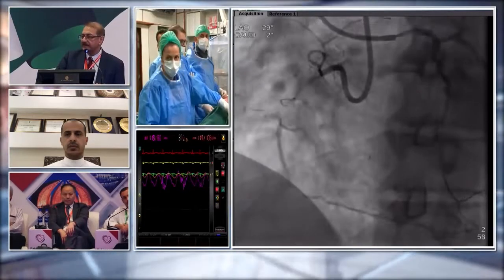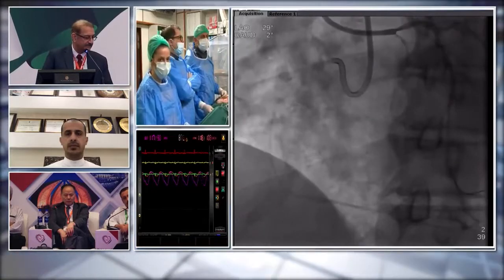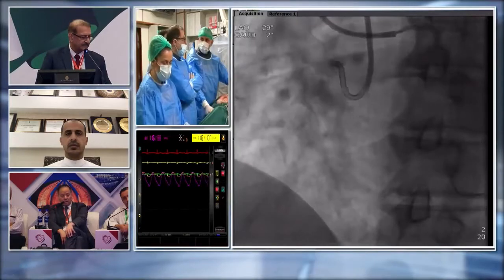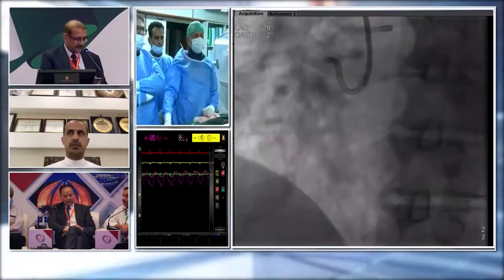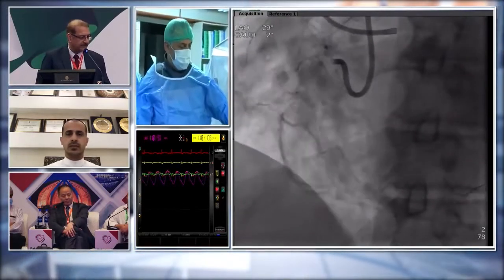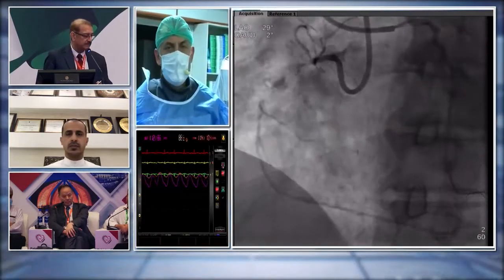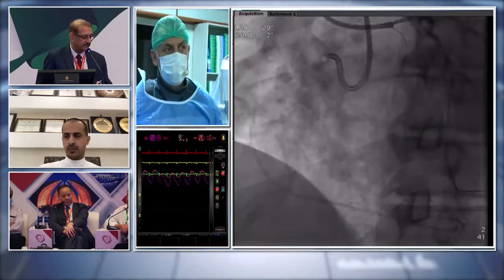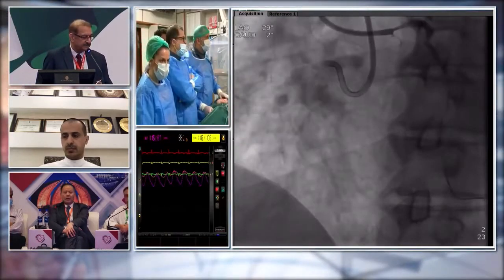Because they can't hear. Omar, a simple question, now that we have this left main question going on: is this a side hole left main catheter or a standard catheter? No, I don't see a side hole. We are working with a biradial approach today. Both catheters are 7 French. In the left we have a left EBU without side hole, and for the right we have an AL1 catheter. So we don't have any side hole for the left system.